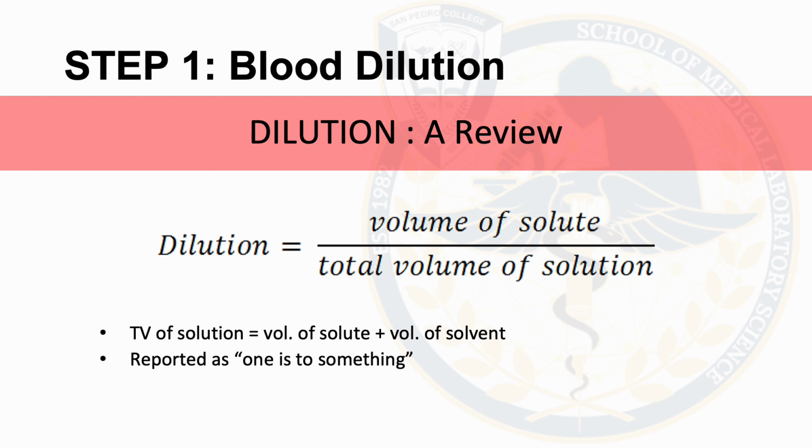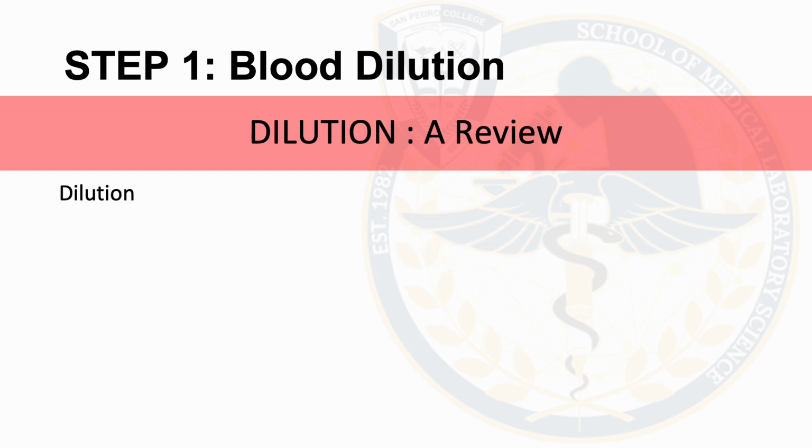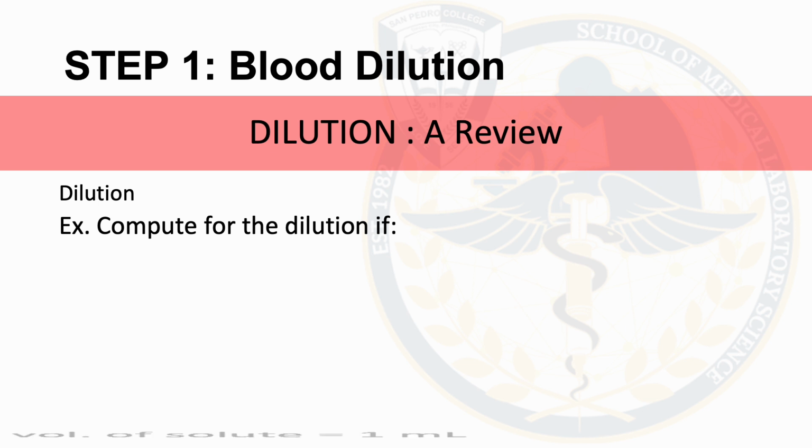Okay, and this one is reported as 1:something. For example, 1:3, 1:4. Since we are talking about dilution, that's normally the manner of reporting, particularly in your dilution. Okay, so now, let's try to compute for the dilution.